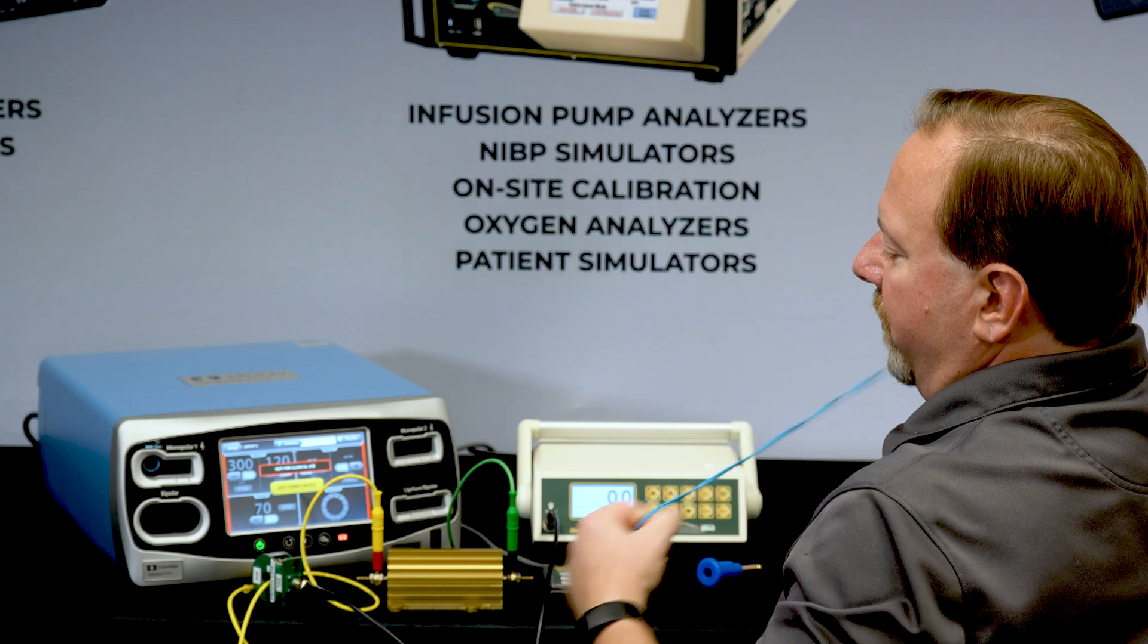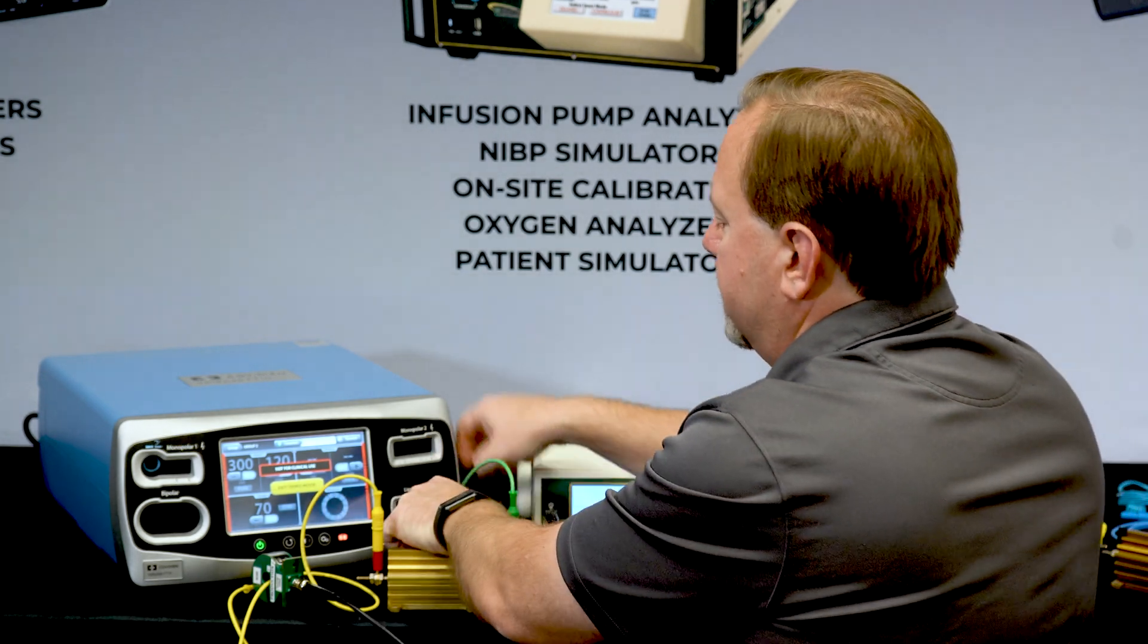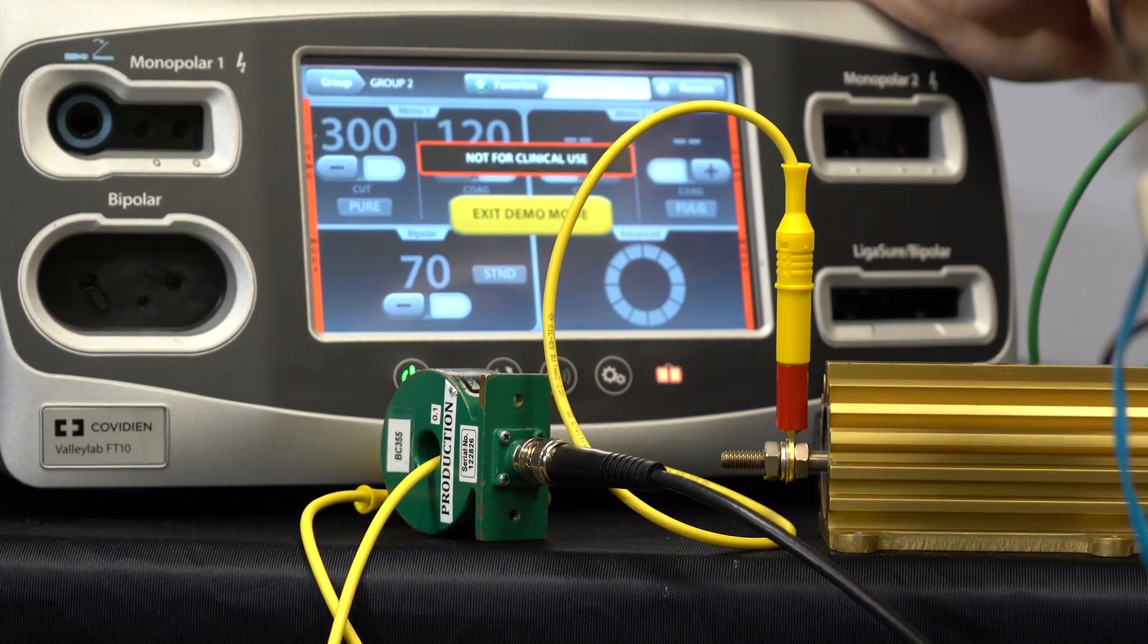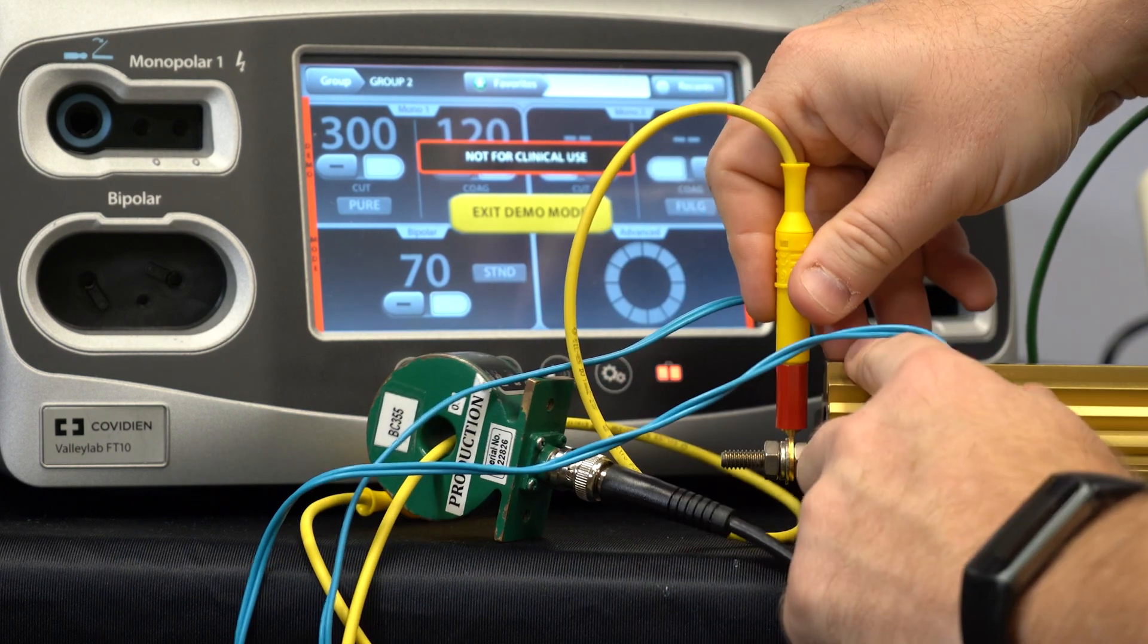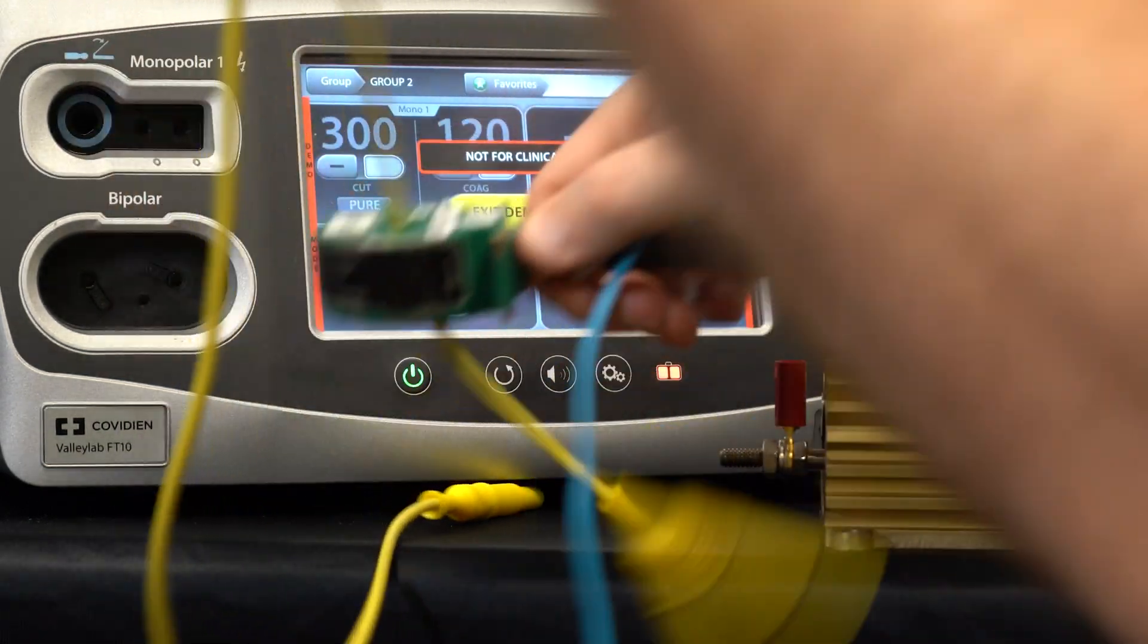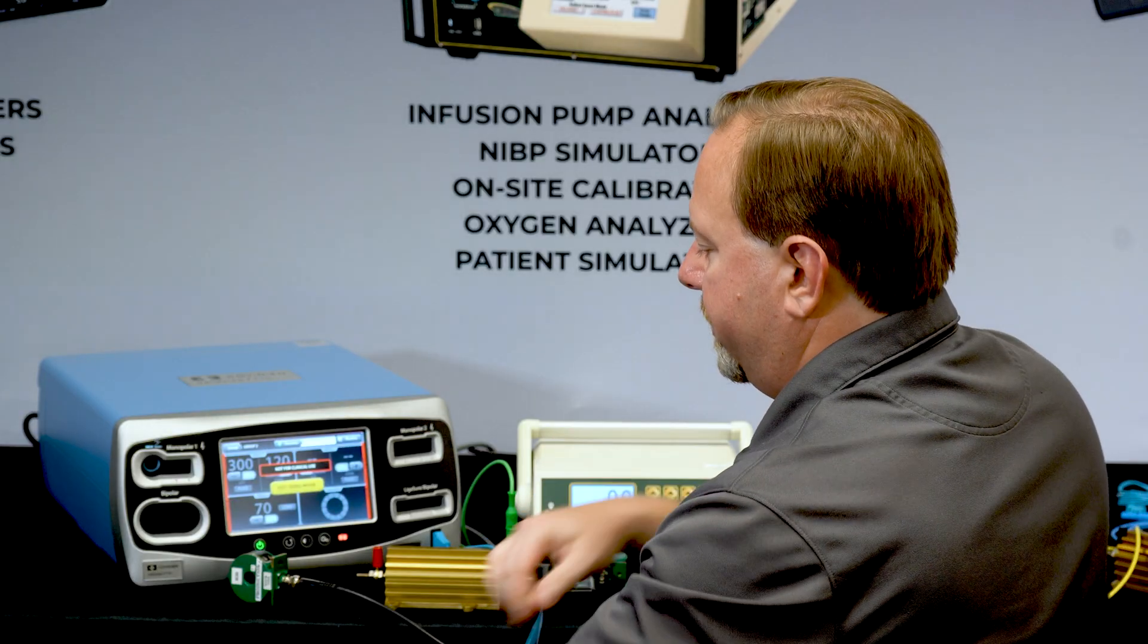The other measurement we need to make for leakage on monopolar one is on the REM port. So we need to make sure that the REM port does not have too much current going to ground. So for this test I'm going to remove the yellow electrode that I had through the current transformer and I'm going to connect my return electrode through there.